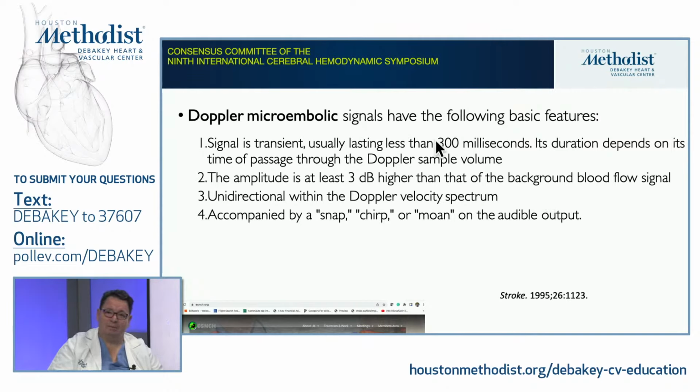One of the key elements, and again, hopefully my physicist buddies will help me, is the duration. This is definitely too long. For me it is probably less than 100, even less than 50 milliseconds. How long is that signature and the sound? The amplitude of 3 is a little bit not enough, because that will have so many artifacts that maybe we need to pop this up to 6 or 9. And again, the sound needs to be there. So it's very important that we see that.